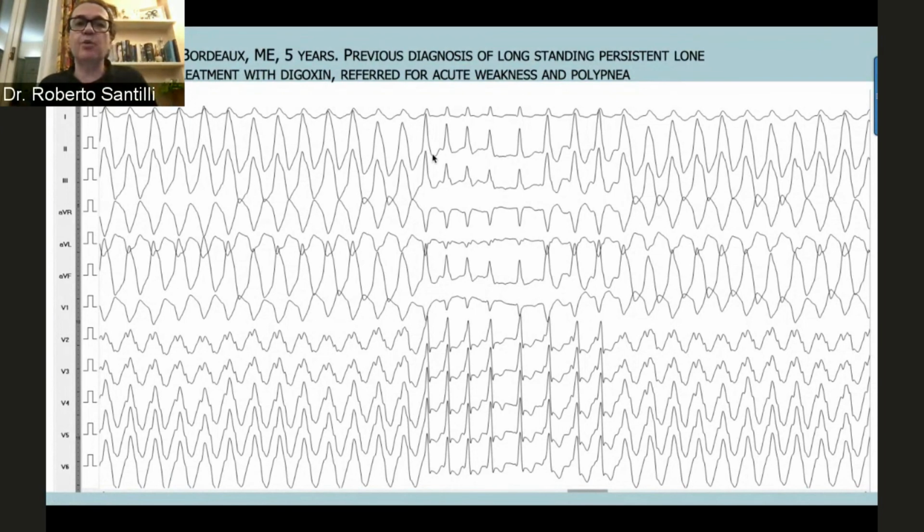Remember, it's very, very important. In our experience, and we have read 100,000 Holters, we never found a case in which amiodarone controlled the ventricular rate, despite it having, other than class 3, also class 2 effect, so beta blocking effect. We couldn't find any case of a decreased response. We did find cases of cardioversion and restoring of sinus rhythm, but we could not find any case of control of the ventricular response.